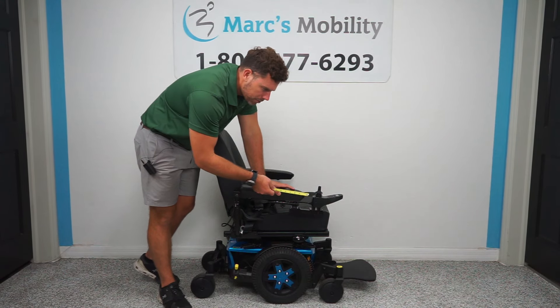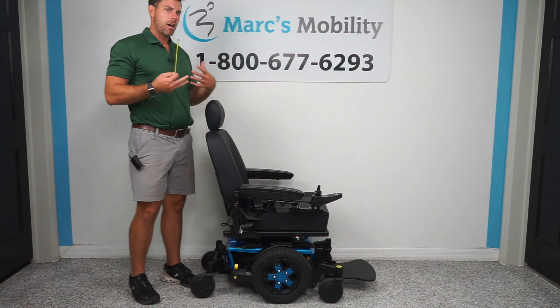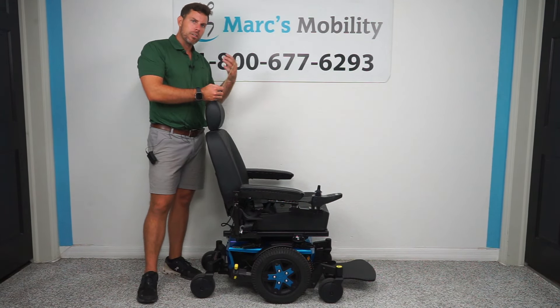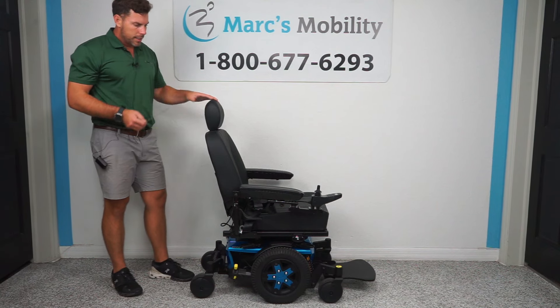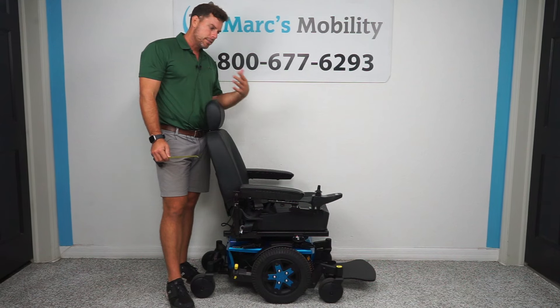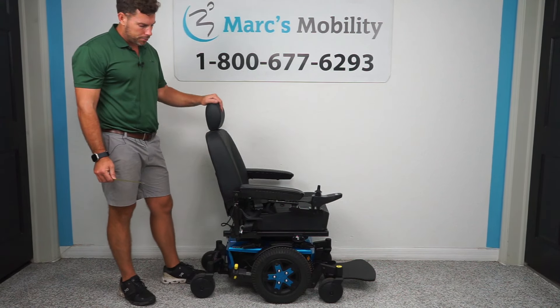Quantum does make a front-wheel-driven unit and they have just come out with a rear-wheel-driven unit, so we do sell other different drive configurations. If you're looking for a Quantum, let us know or visit our website and we'd be glad to show you what we currently have. This unit here is going to have very, very minimal usage. We're not able to actually pull the total drive distance or time off this joystick, but this was really, really gently used.